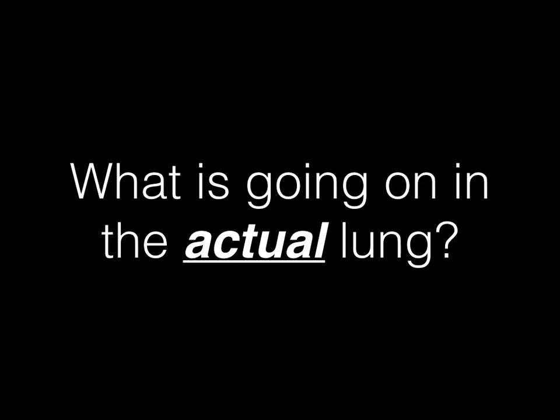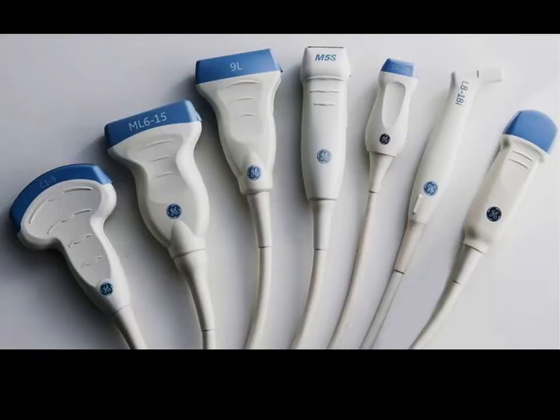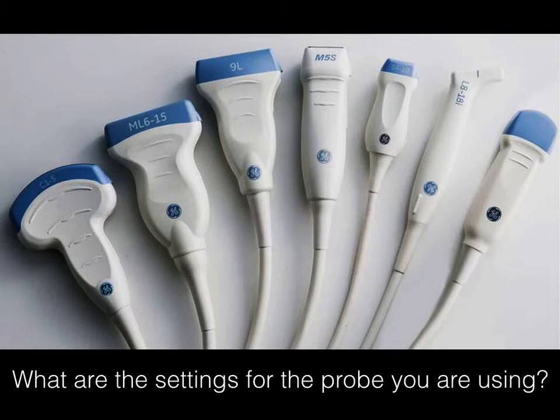Well, if we want to look at the lung, first things first, let's choose a probe. We've got many to choose from. Some are going to work better than others. And it's not because of the shape or the frequency per se, but it more so has to do with the settings. So we've got to ask ourselves, well, what are the settings that are preset into the probe that we're using? And the reason for that is this.